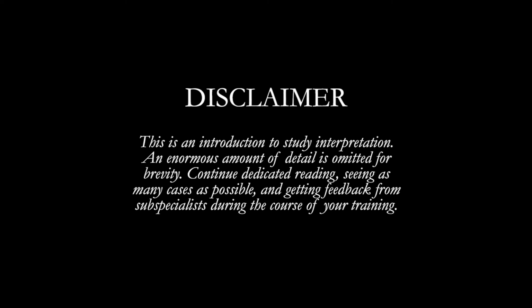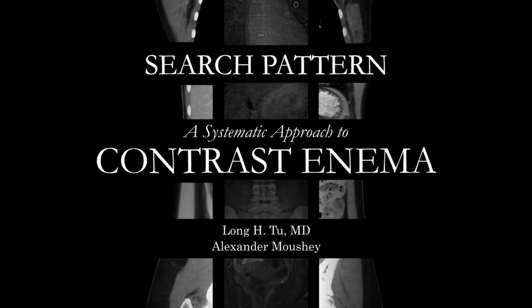Please note that this is an introduction to study interpretation. An enormous amount of detail is omitted for brevity. Continue dedicated reading, seeing as many cases as possible, and keep getting feedback from subspecialists during the course of your training. All right, so today we're going to talk about a basic approach to the pediatric contrast enema.